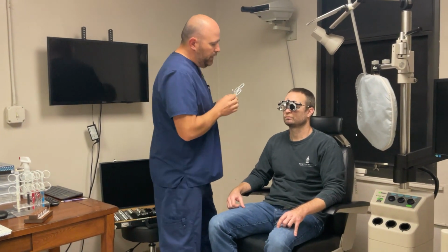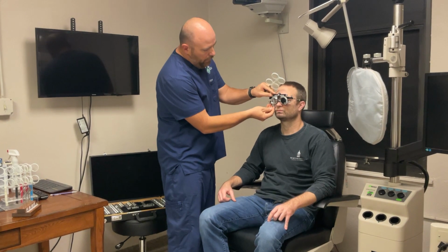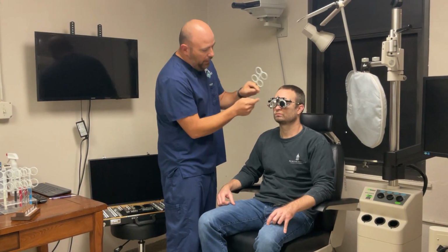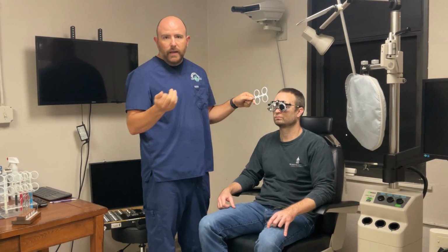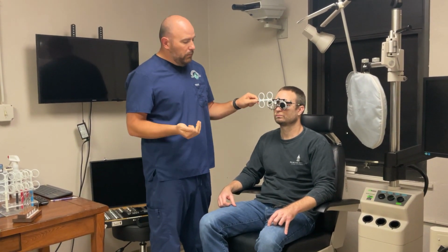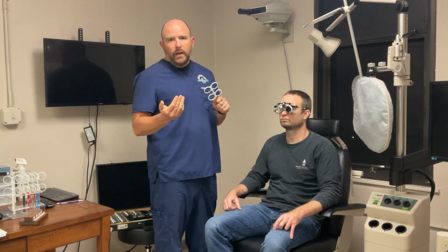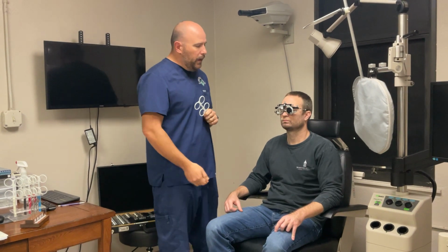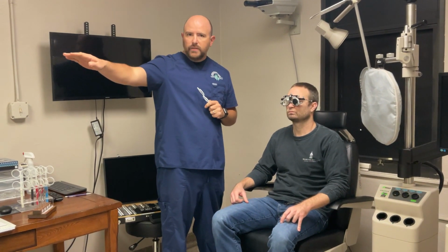With the plus or minus flipper, what I'm going to do then with a plus or minus 4 lens in the back well there. If I show him a plus a half, then I'm showing him minus 3.50. If I show him a minus a half, then I'm showing him minus 4.50. And so in this way, we're able to bracket a whole diopter just like before. Now, as part of the final sphere testing, we need to change our patient's fixation.